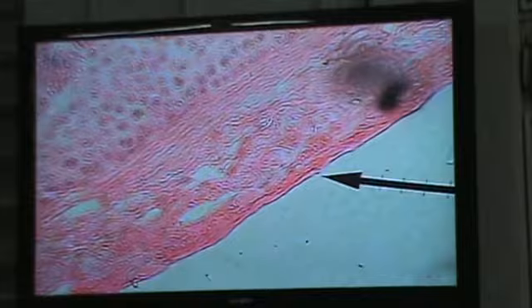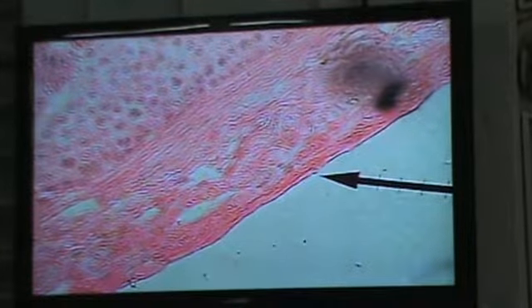So what you see there is the remnant left back in the spermatic cord known as the processus vaginalis. But there we see tunica vaginalis, and deep to that tunica vaginalis there is the fibrous layer, and that fibrous layer is known as the tunica albuginea. Now at the deeper layer, we really look at it in different testes here. The deeper layer we see a vascular layer, and there's a lot of vascularity, and we trace it along here. You may see and encounter some blood vessels.